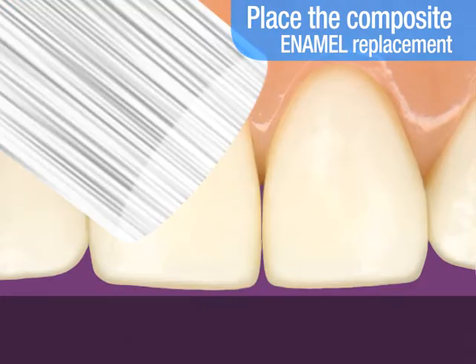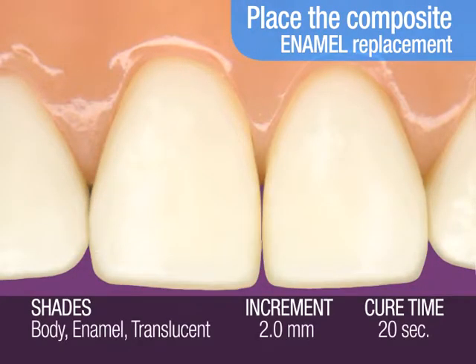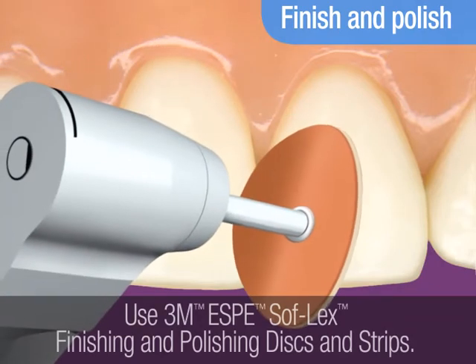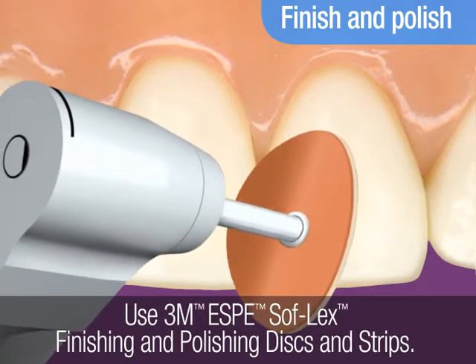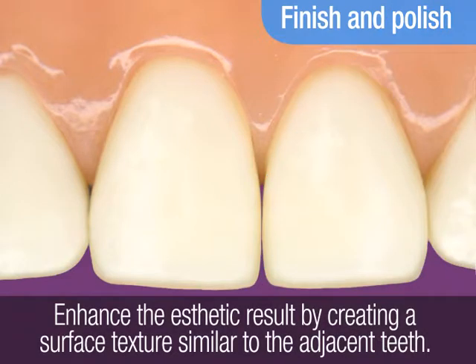Light cure. The recommended light cure time for each 2 mm increment of enamel or translucent shade is 20 seconds. Lastly, finish and polish the restoration using 3M ESPE Soflex finishing and polishing discs and strips. You can enhance the aesthetic result by creating a surface texture similar to the adjacent teeth.